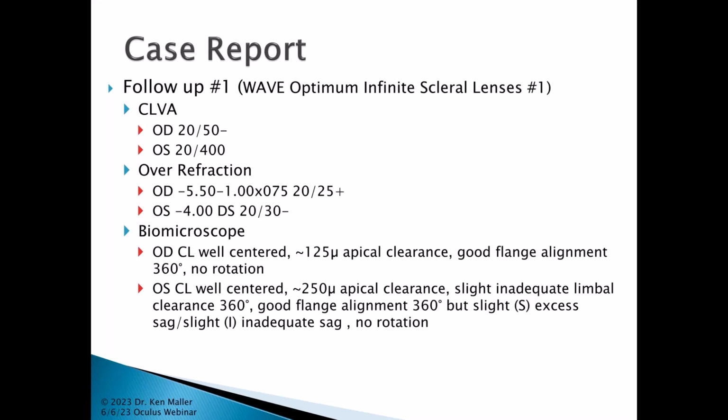Good flange alignment, but there was a little bit of excess sag superiorly and a little bit of inadequate sag inferiorly, which really isn't a surprise given that my lens only had the 400 microns of difference between the superior and inferior, and I had measured something like 2 millimeters there.